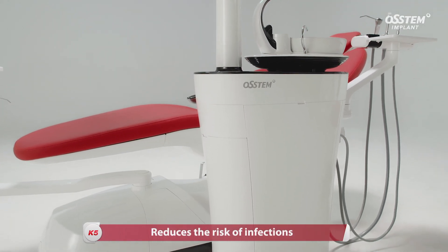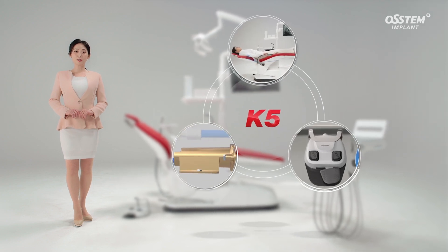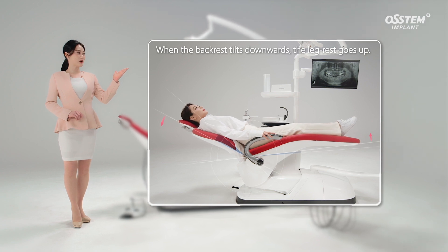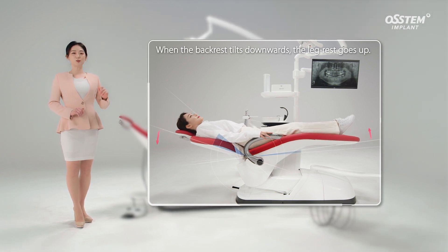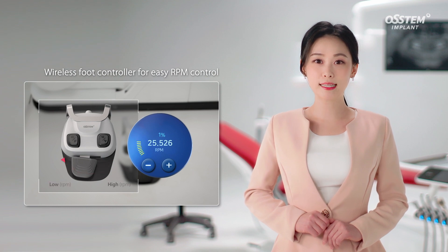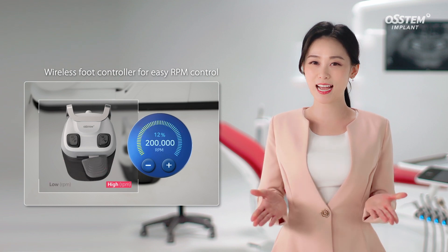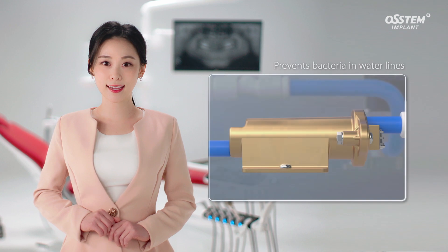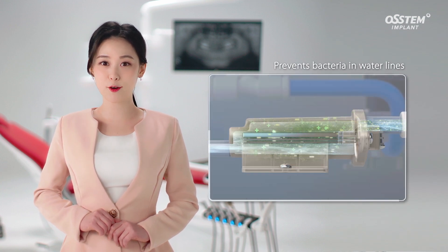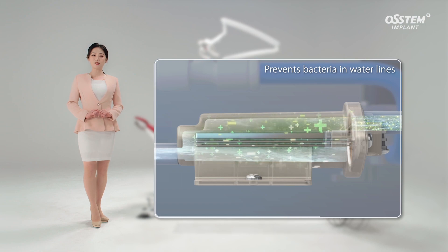Let's go over the K5's key features again. First, the patient does not slip downwards thanks to the tilting function — when the backrest tilts downwards, the legrest goes up. Second, the wireless foot controller makes treatment much more convenient for the clinician. Third, DWCS suppresses bacteria in the water line to supply only clean water during treatment.